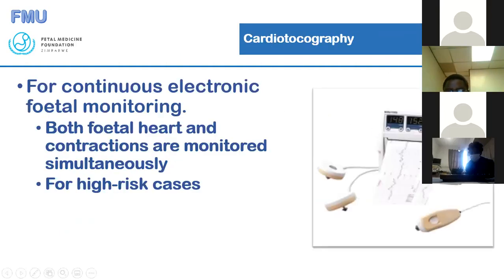So this is how it looks. Of course, ours are different from this one, but a CTG is going to have an LCD screen that will display the values. It is going to have the tocometer, which has a dimple in the center. This is what picks the change in tension or pressure. Then the cardiometers are these probes which are plain on their surface. They come in two to allow for twin monitoring, so there will be two of them.